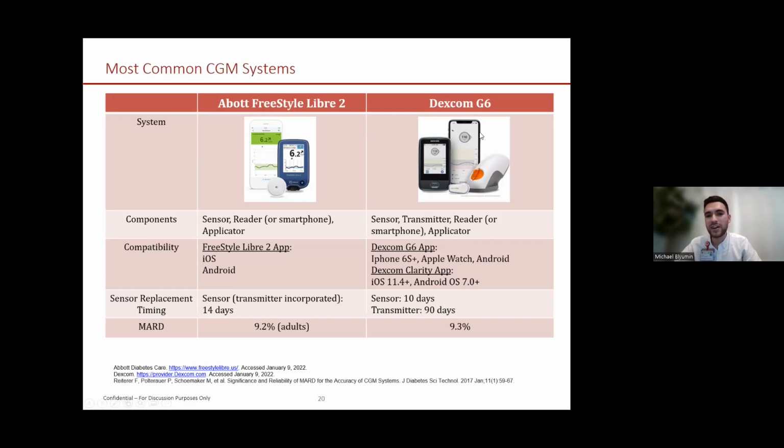And here we have the Dexcom. This is the applicator. This is the transmitter, and it's attached. It goes onto a sensor, which goes on your body, and then the reader if you're using a reader.